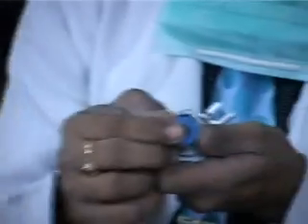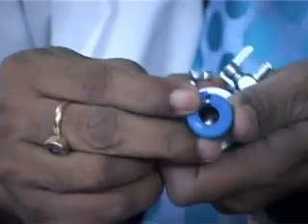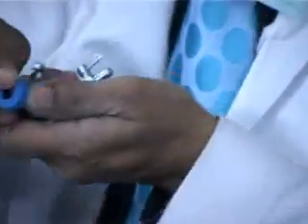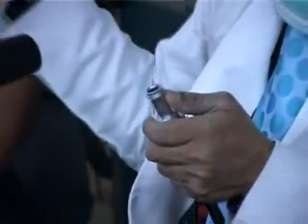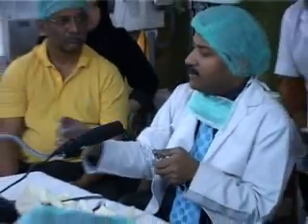And even if the reducer is there, even if good quality instruments are there, just due to this 10 rupees washer, it is leaking all the way. Every time it will keep on leaking. And if you don't have this one, now you are in trouble. You should immediately replace it.